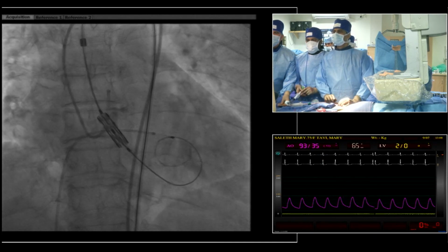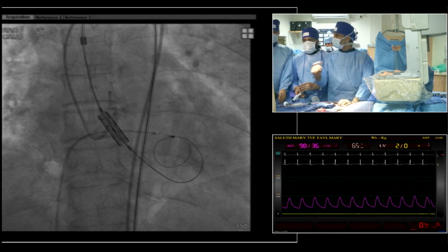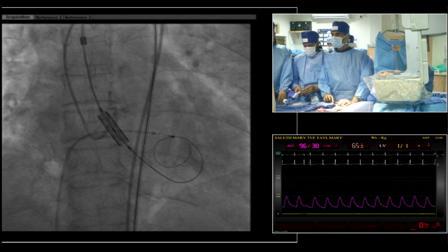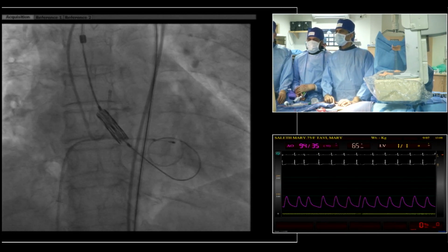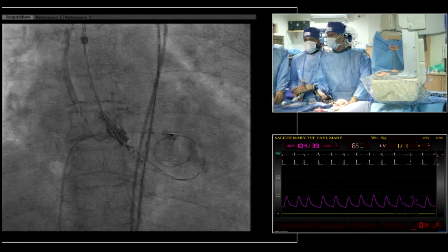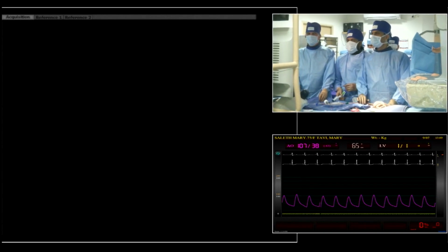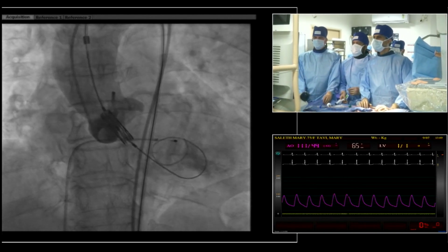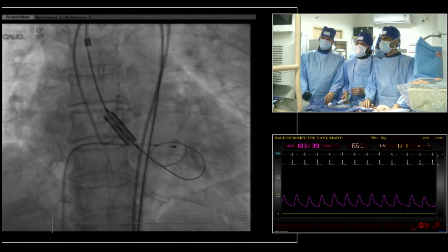But now, patients who do not have heavy calcification, those who do not have very severe stenosis, you can go without. That's right. So that's why the 95% has been pre-dilatation. That's been as a caution rather than the necessity. And as the experience with the valve has grown, remember this is the first use of a direct balloon-mounted valve without any sheath.